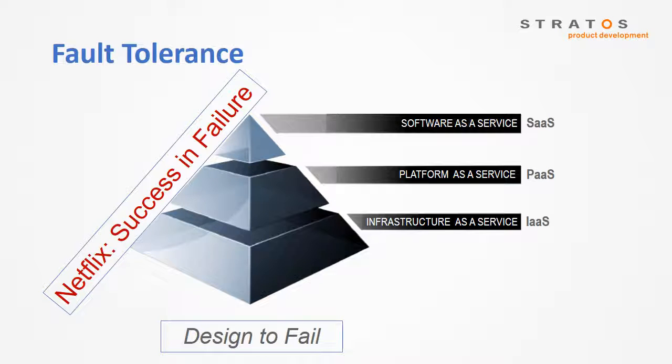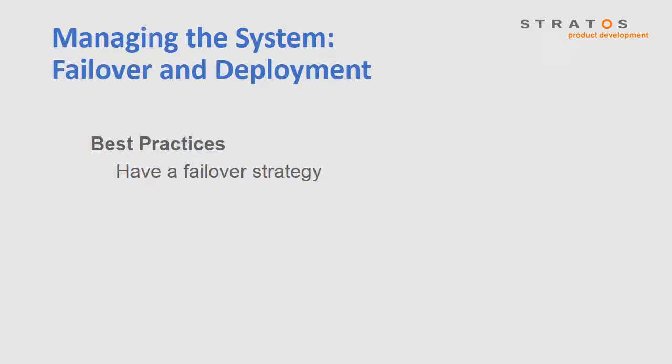This is also how Netflix survived a major cloud services outage in 2011, although many other services went down. Its systems continued to run on different hardware in different regions, and their system did not go down. So, what will your strategy be for failover? For a conventional medical device, that question might not make sense, but for a cloud system, it is essential.